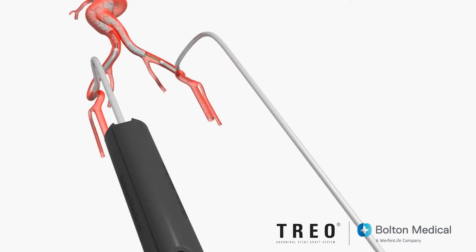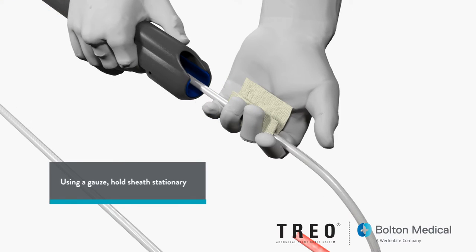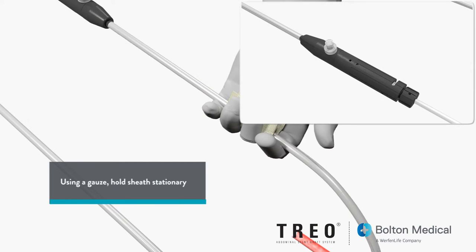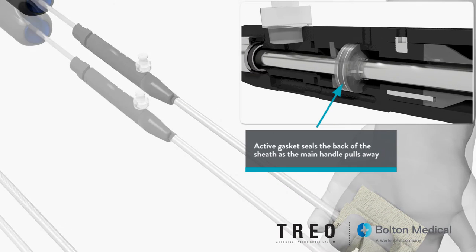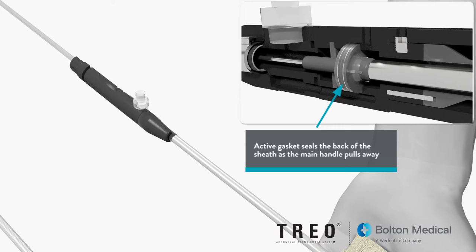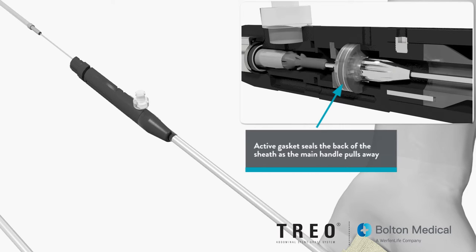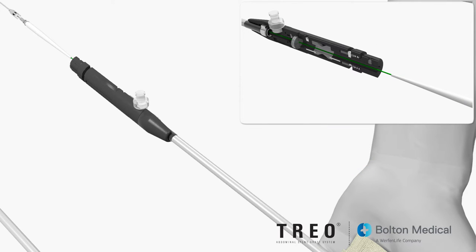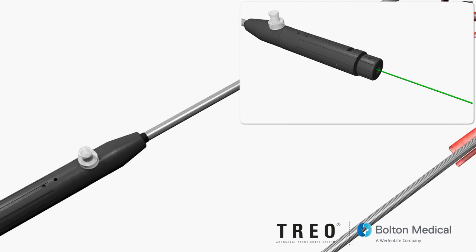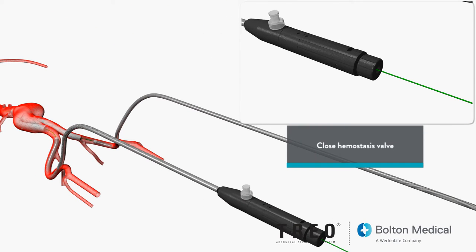Using gauze to hold the main sheath stationary, continue to slide the main handle away from the main sheath as the sheath hub assembly disconnects from the handle. A passive seal blocks blood flow from the back of the sheath as the main handle pulls away. Continue pulling slowly and observe as the delivery system tip exits from the hemostasis valve housing. If necessary, close the hemostasis valve after the tip exits the housing by turning the knob clockwise. Remove the delivery system handle assembly until it clears the guide wire.